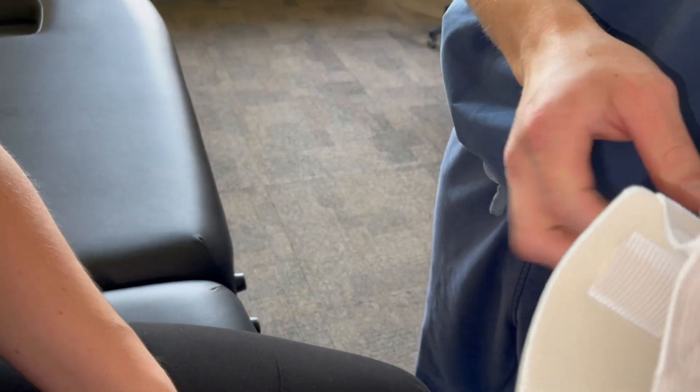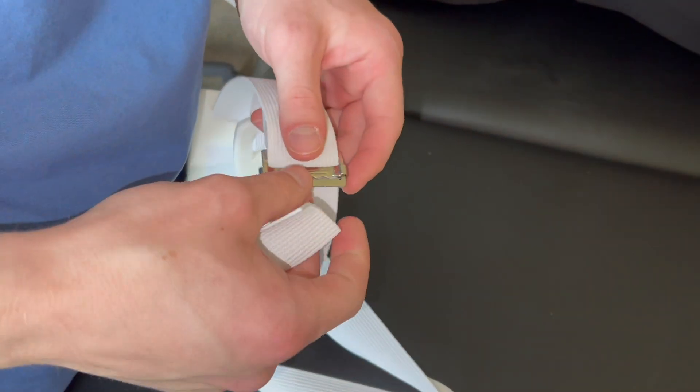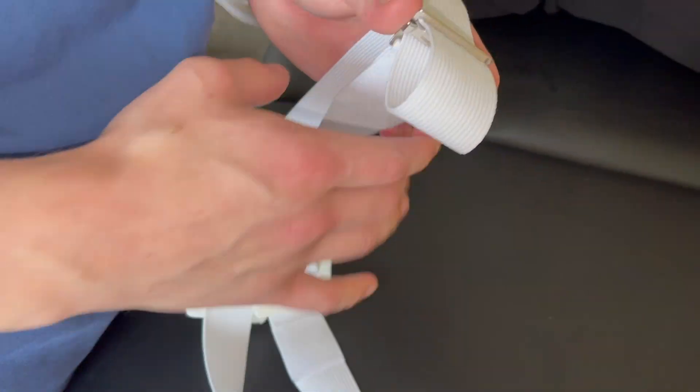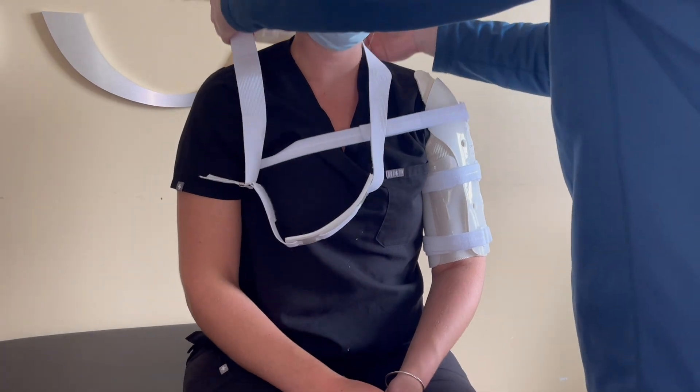If you were instructed to wear the sling portion of the brace, lay the sling flat. Locate the two fastener pieces and attach them together — this is where your wrist will rest. The strap of the sling should be fed through the metal buckle. To do this, start from the inside and feed the strap through the teeth and adjust as needed.